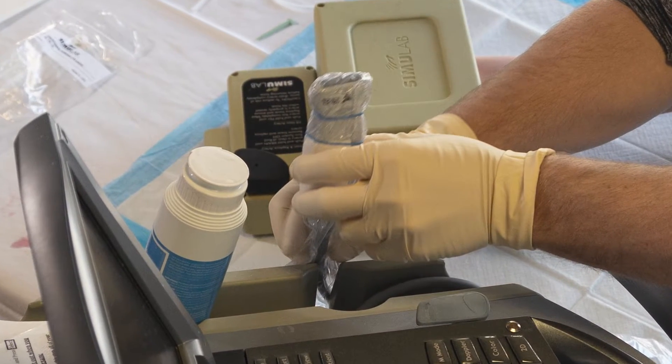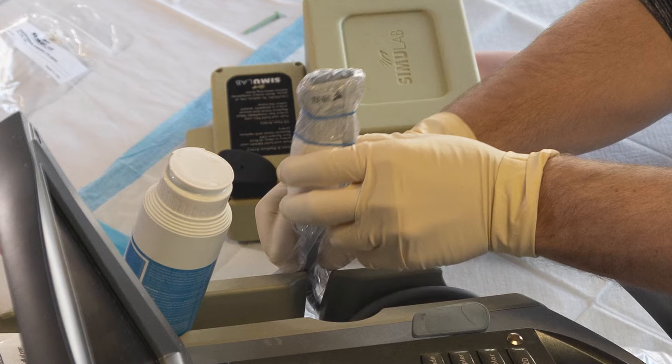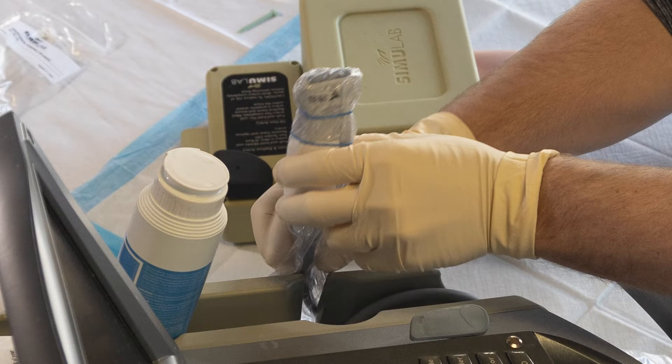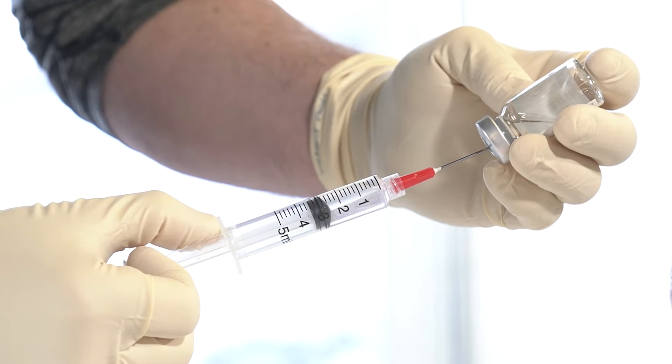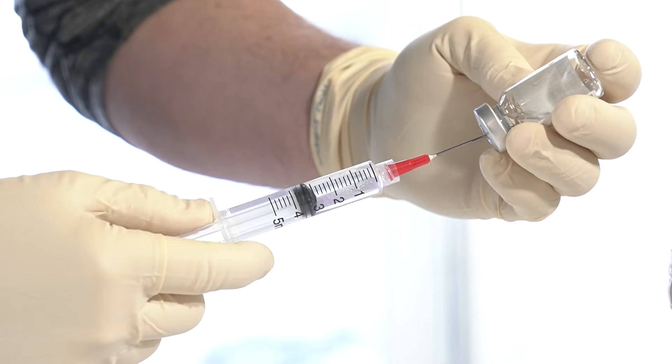Set up the linear vascular probe of your ultrasound with a sterile probe cover and place this in your field. Draw up 1% lidocaine and anesthetize the site in the typical fashion.